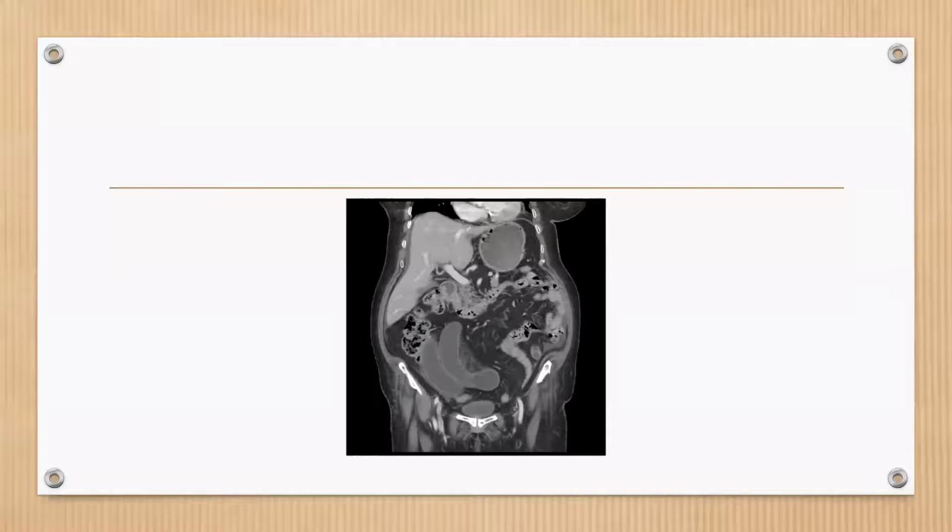Free fluid was seen in the abdomen and pelvis.